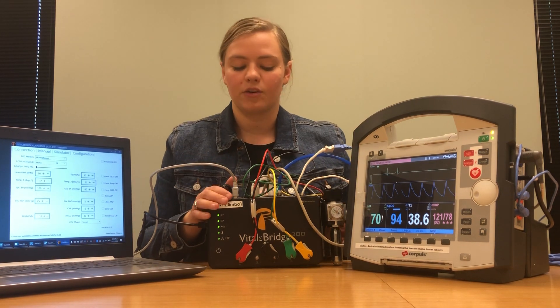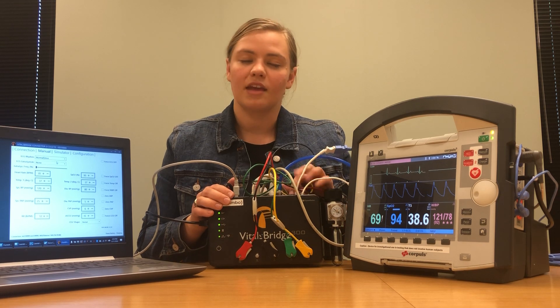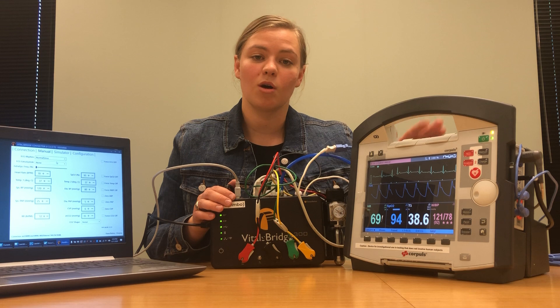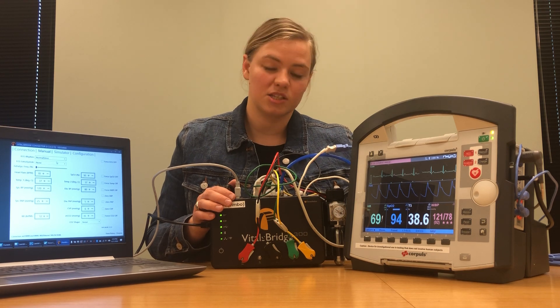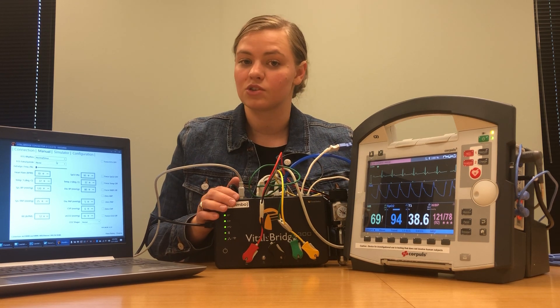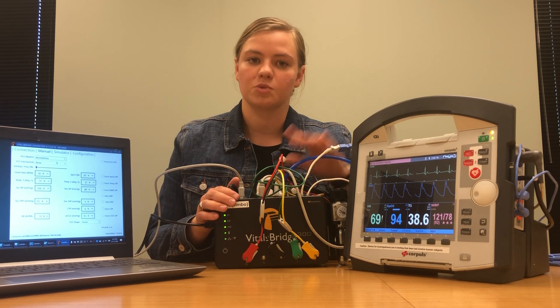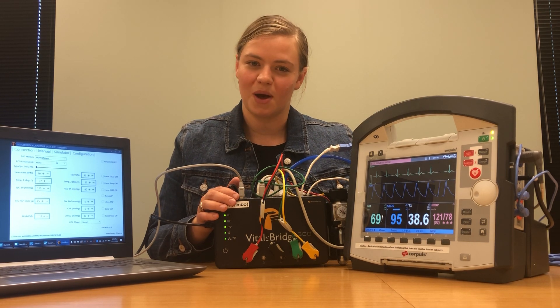The VitalsBridge 300 also supports invasive blood pressures on some patient monitors. Unfortunately the Core Pulse patient monitor is not supported with invasive blood pressure readings, so you cannot connect invasive blood pressure readings from your VitalsBridge to your Core Pulse patient monitor.